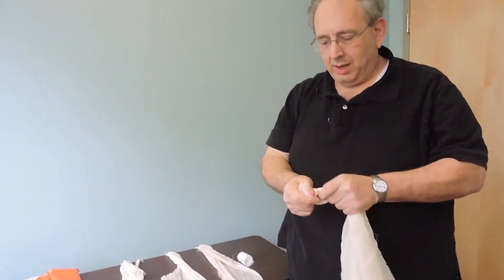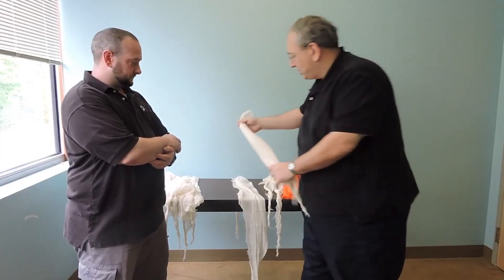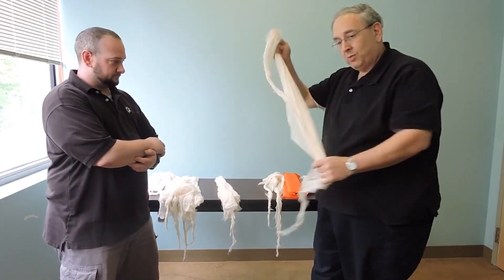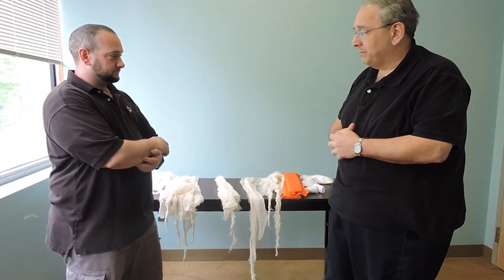Put a little knot in that and just set that aside. You'll also need another swath to use as a cravat across the arm.